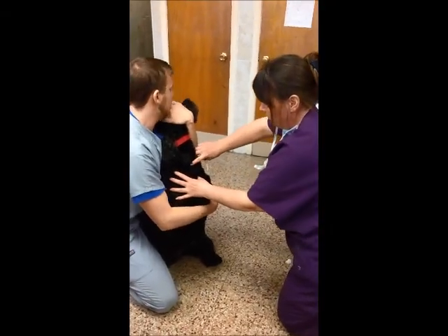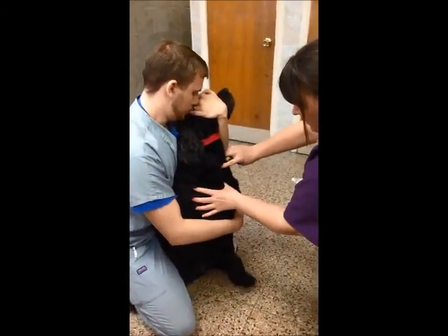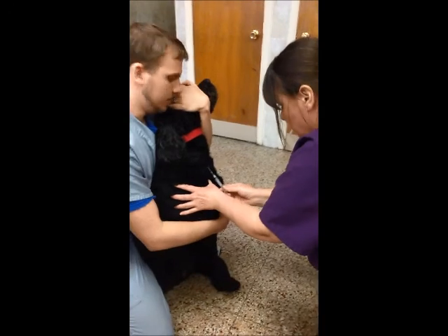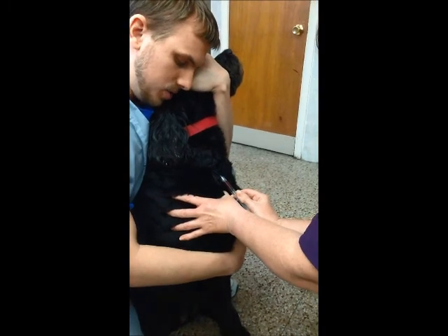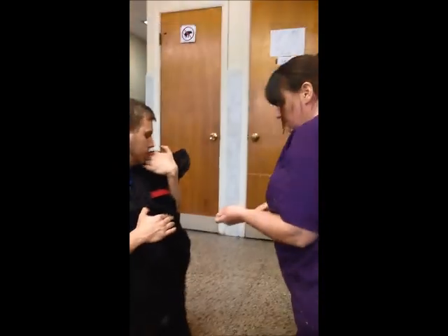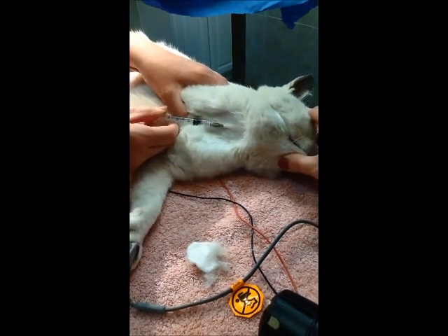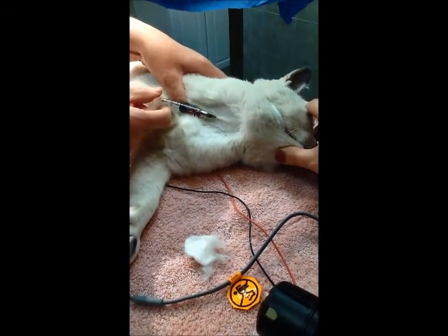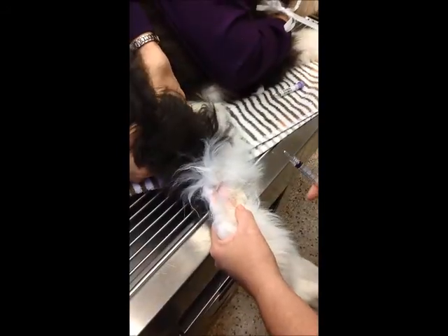Alright, so we're going to do a jugular vein. We're going to apply pressure right in here and allow it to pump up a little bit. Jugular stick on a cat. Ready? Recording.